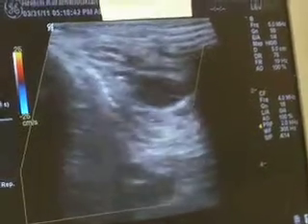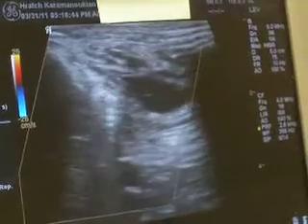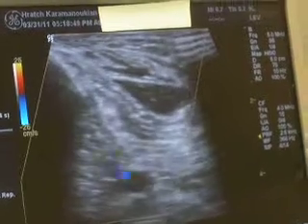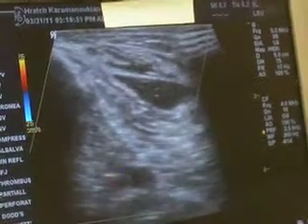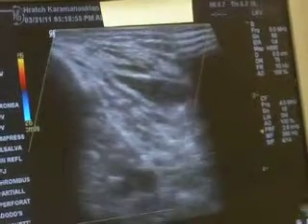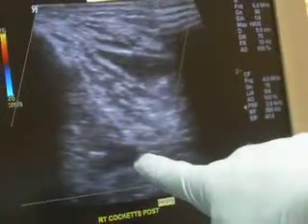Okay, put the color flow on. I'm going to squeeze his calf and do all the maneuvers to see if there's any color. I'm squeezing his calf and there's nothing there. You can see the deep veins right here — artery and vein — but this is the perforator vein. No flow up there. Good.